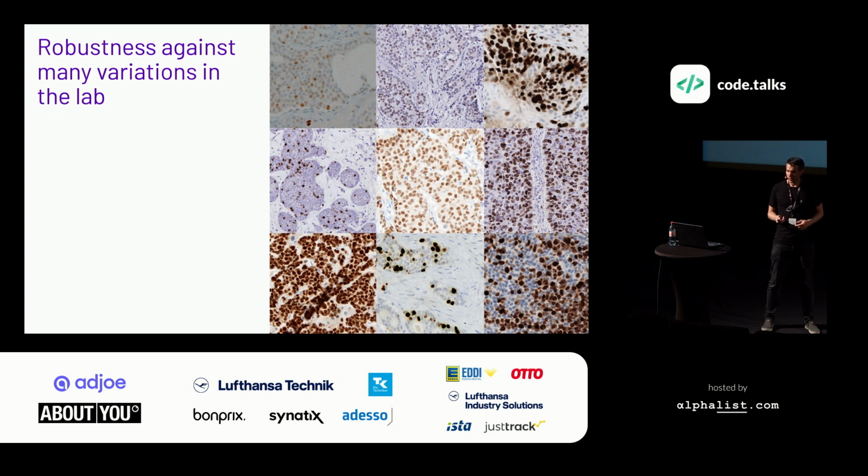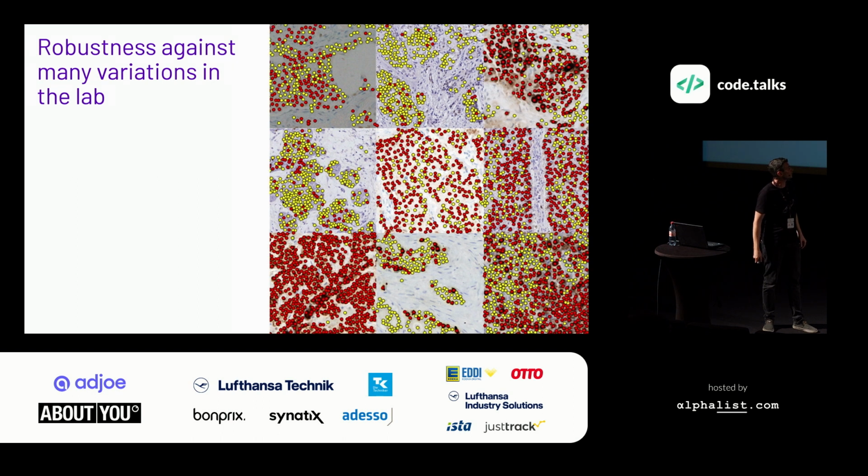So just to illustrate again, here are a lot of variant images. And when we apply our model, it can detect cells on all of these.